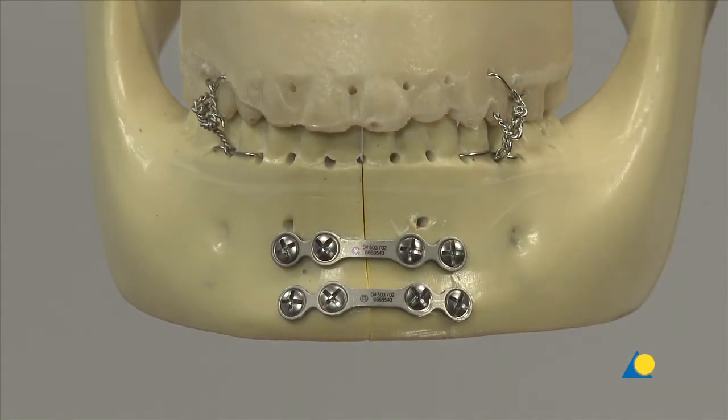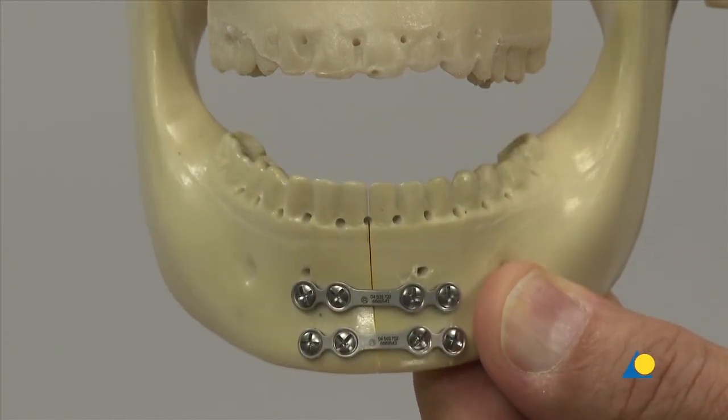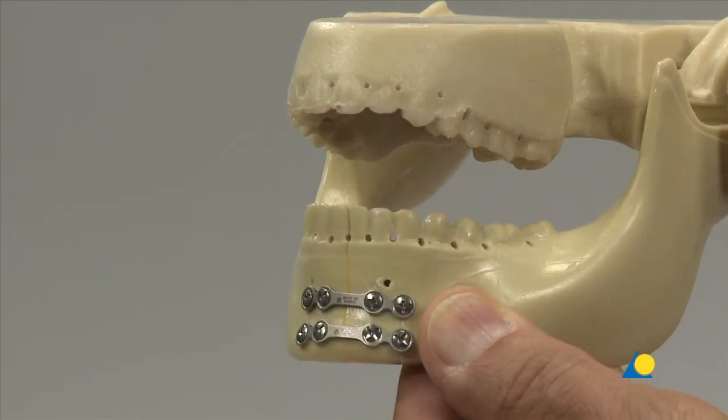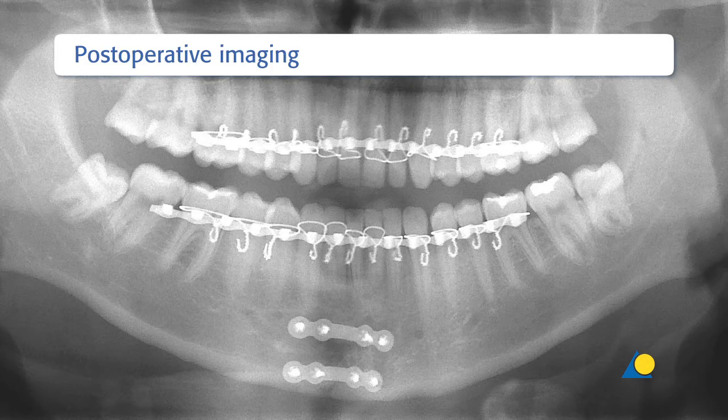After osteosynthesis with two mini plates in isolated median and paramedian fractures, no MMF is needed. However, it is recommended that the patient stay on a soft diet for 4 weeks. The mandible is now stable and limited function is allowed. The post-operative X-ray illustrates the clinical result.